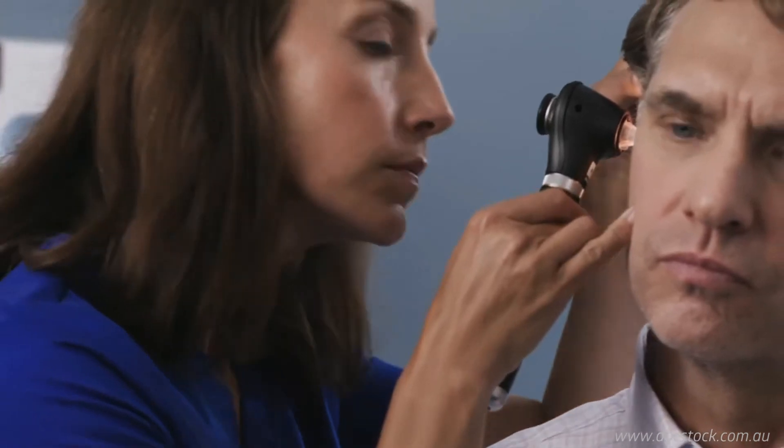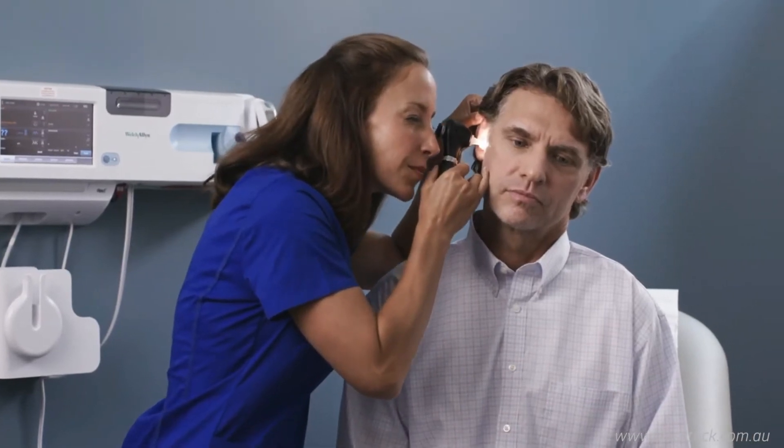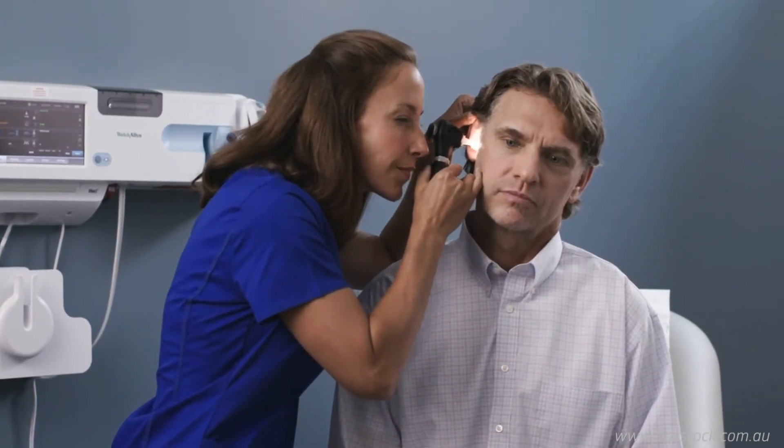Guide the otoscope into the patient's ear to view the canal and tympanic membrane. It may be necessary to adjust the position of the otoscope to get a complete view of the entire ear canal and all areas of the tympanic membrane.